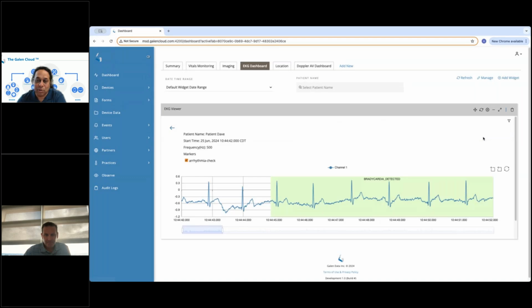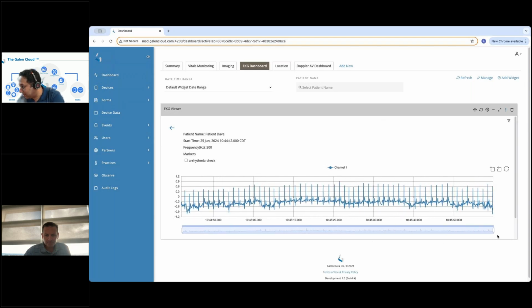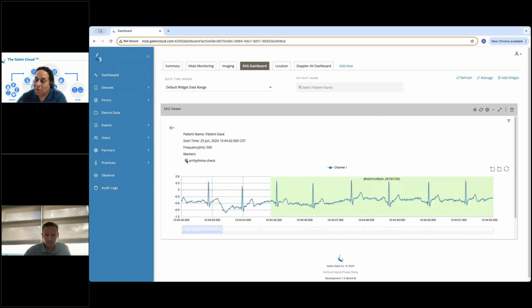And then it was routed to B-Secur's rhythm detection engine in this case. What they did is essentially detect arrhythmia, specifically a bradycardia rhythm here. You can see the raw signal if I take away the markers. So there's a raw signal here, a couple of minutes long, just standard EKG signals. And then what the B-Secur algorithms did is essentially go through the signal and identify a potential bradycardia event. So that's what the algorithms can do.